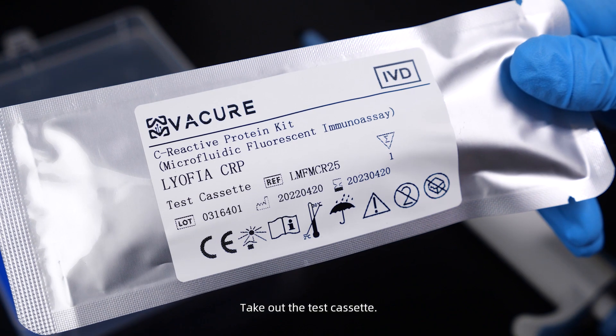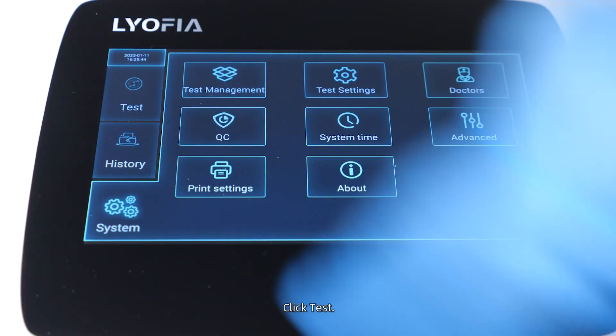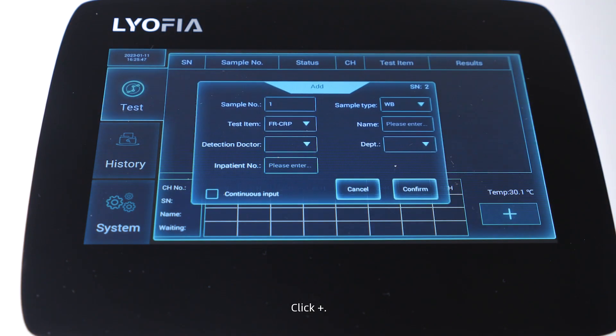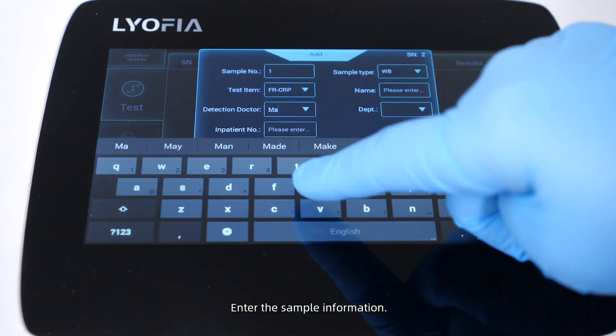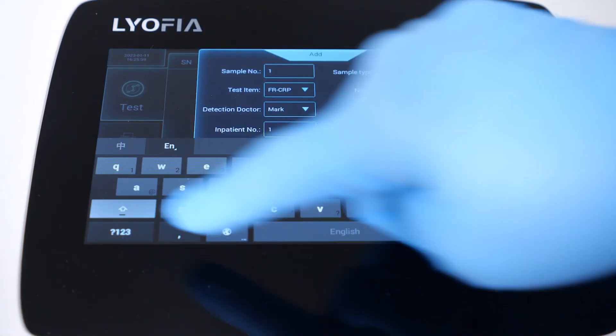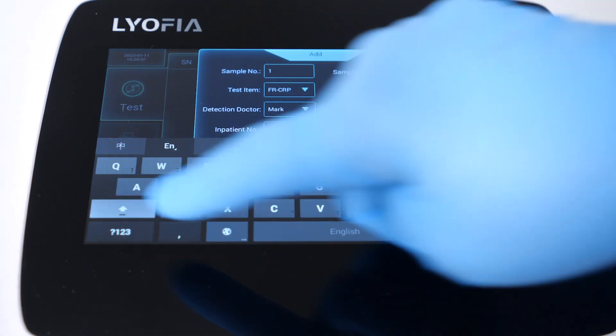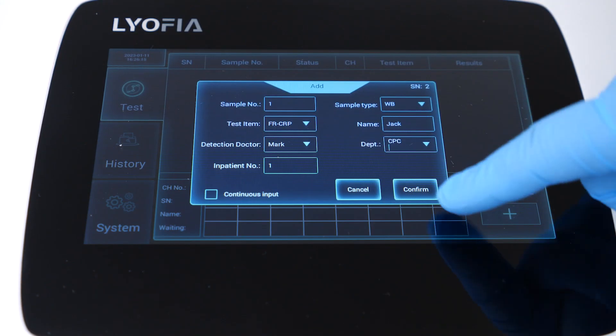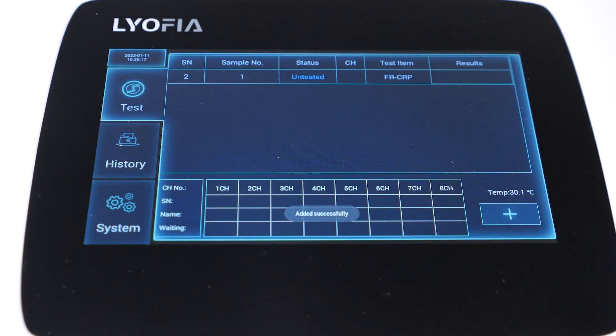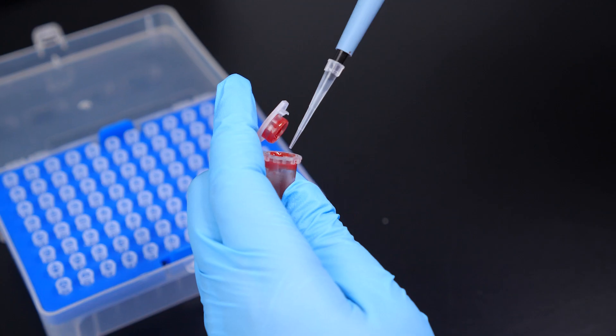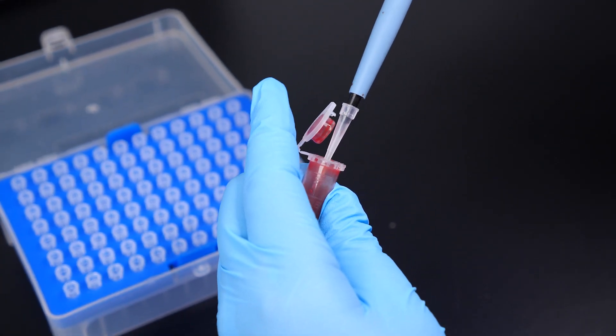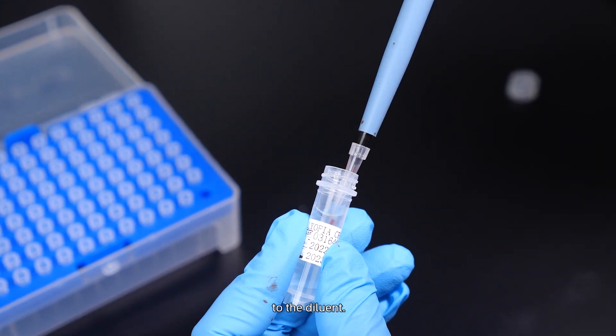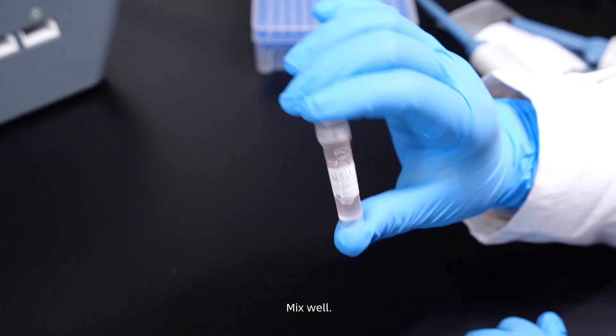Click Test, click Plus, enter the sample information, click Confirm. Add the sample to the diluent and mix well.